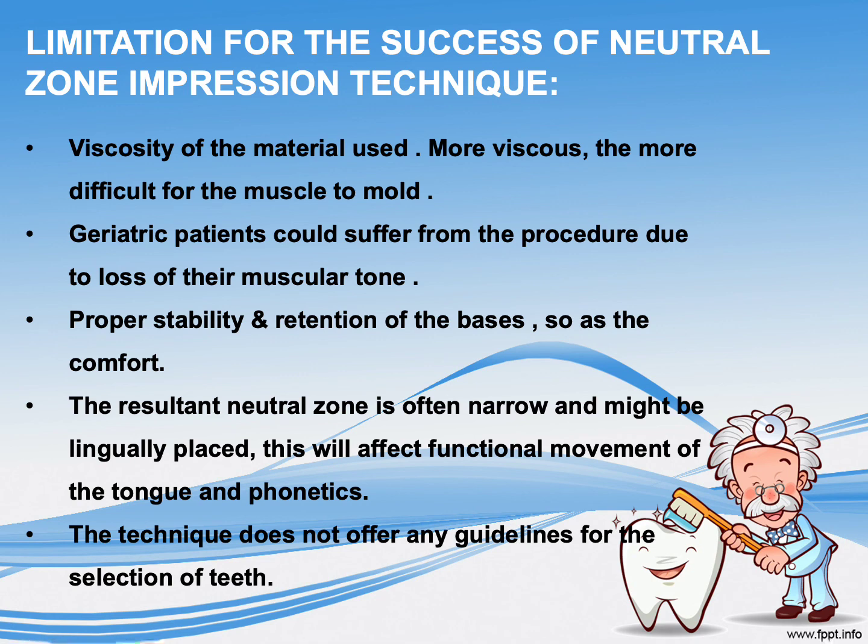The resultant neutral zone is often narrow and might be lingually placed. This will affect functional movement of the tongue and phonetics. The technique does not offer any guideline for the selection of teeth.